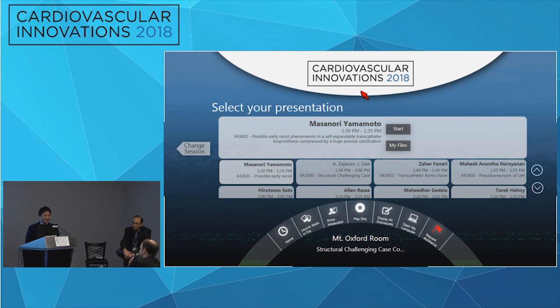I would also challenge you, because I think the fact that you had AI and the fact that it collapsed means that you probably implanted too low. That's what I mean. I would assume it was too low. It seemed okay, but the radial strength at around 4 millimeters should be strong enough. Yeah. So it's really interesting, I've never seen something like this, actually.